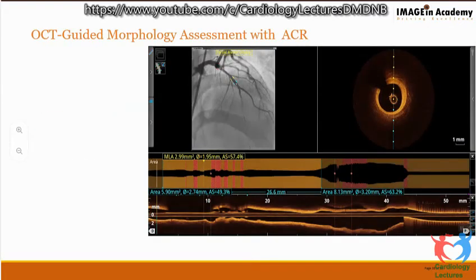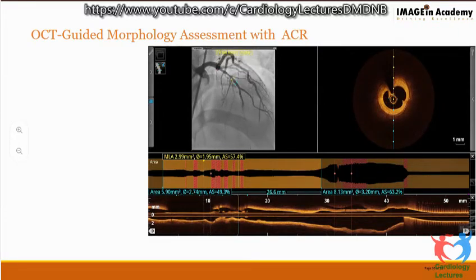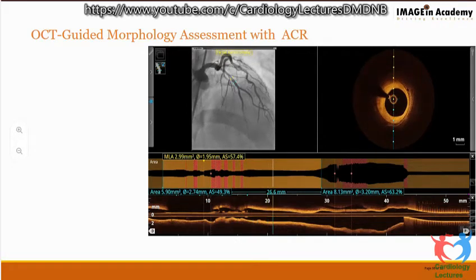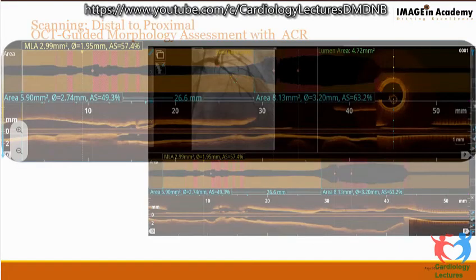So we went ahead and did the OCT, and this is the LAD, distal to proximal. Now you can see a weak thrombus. It's kind of a honeycombing of the vessel. Multiple septae, these are nothing but the fibrin strands which have been left behind in an organized thrombus where the RBCs have resolved. The proximal segment appears to have a little bit of plaque, but not so significantly diseased.